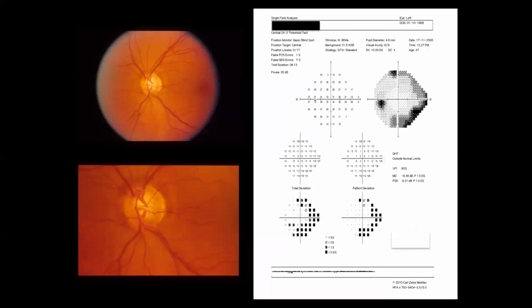So what do you mean by false positive and false negative? What's the importance of false positive and false negative? What do they mean for us? They mean for us that we can rely on this test, and they tell us what the patient did during the test itself. Exactly. So false positive is what exactly? It's when the patient is trigger happy. Exactly. So he keeps pressing the button for a stimulus which is not existing. Yes, yes.